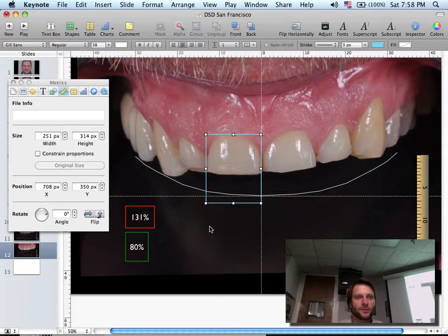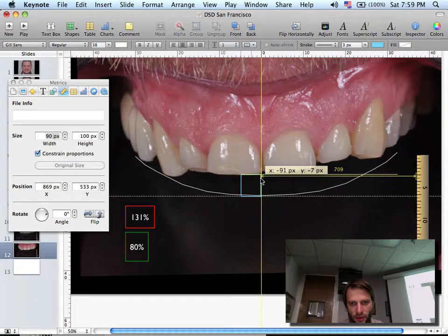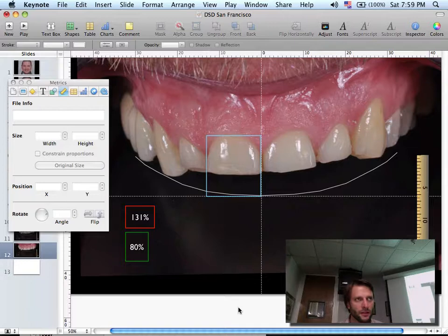If I want to check what happens with the 90%, I have to write 100 over here, 90% over here, and press enter. Once I do this, I constrain the proportion, I place it over here, and I stretch. This is pretty much what will happen. So if we don't change the width, if we don't change the cervical margin, and we lengthen around 3.5 millimeters, we can still create a decent central. So this gives me a nice reference that if I lengthen 3.5 or more, I'm in good shape. I'm having a decent shape. So that's what I want to test with my mock-up.